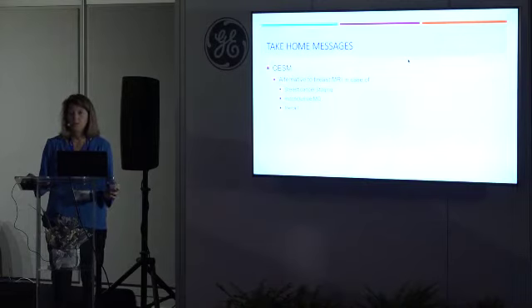So to conclude, I would say it could be an interesting alternative to breast MRI, especially in case of breast cancer staging and non-conclusive mammography. I think these are the two main indications, and also recall, if the patient is recalled after a positive screening. You can start directly with contrast mammography, if you have the technology, since sometimes it's difficult to obtain an MRI in some countries. It depends. And also, interestingly, the same radiologist could do the entire process.